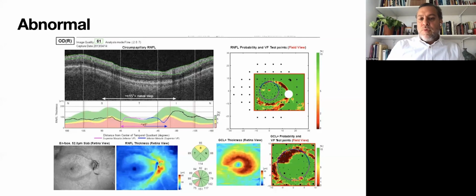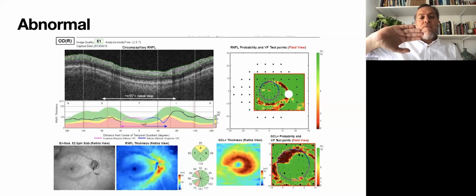So in the visual field, this will show an arcuate defect, superior and also inferior on the 24-2 and also on the 10-2, because the defect is central to the macula. Remember, on the visual field view, you'll have the image of the macula upside down.